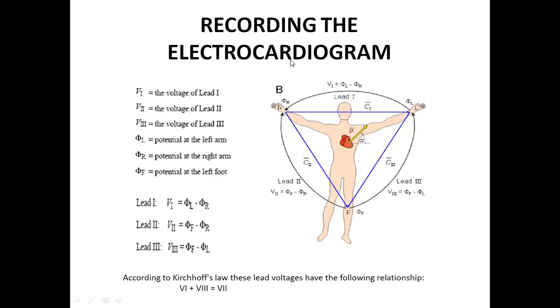In fact, while taking ECG there are a number of artifacts. In communication language it is called noise, but in the biomedical case it is called artifacts. So a number of artifacts come inside the human body, ठीक है? जैसे कि ये हार्ट पंप कर रहा है तो इसके साथ साथ तुम सांस भी ले रहे हो और इसके साथ साथ ब्लड भी फ्लो हो रहा है। So there are a number of noise generative activities occurring in the heart. So to reduce this, the optimum number of leads has been taken as 3. Okay, and it was by research by William Einthoven.